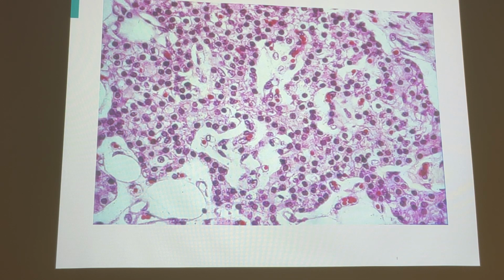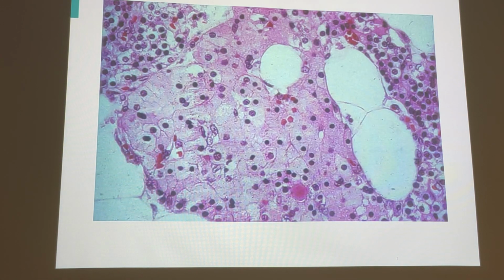So in an older parathyroid gland, it might look a little bit more like this. Much fewer of the small compact cells and much more of these large cells. Again, we're not talking about the adipose. I'm talking about all of these things. These small cells are the chief cells. They're the ones that produce the parathyroid hormone. These other cells are what are known as oxyphils.